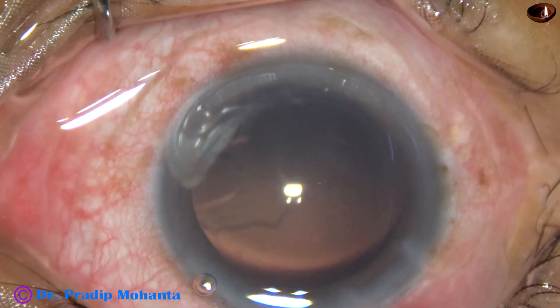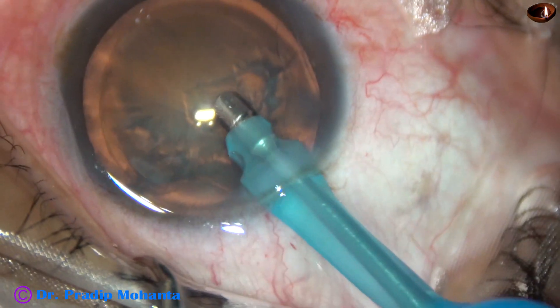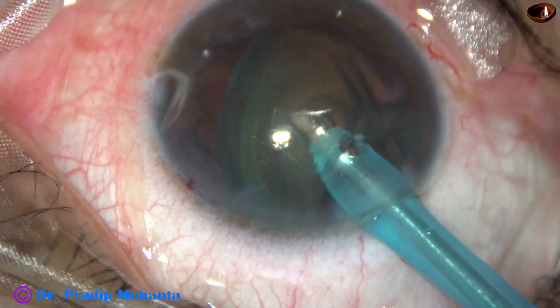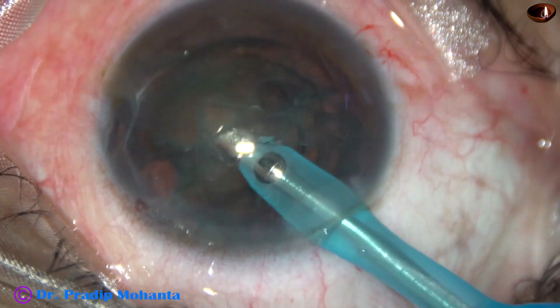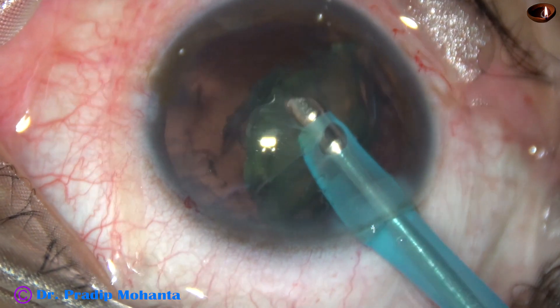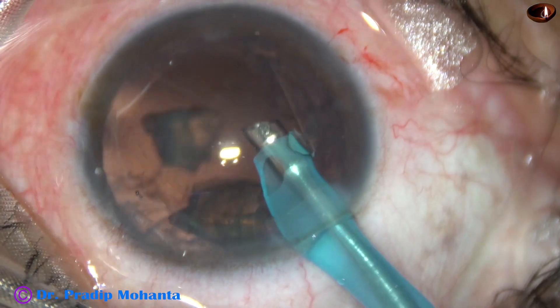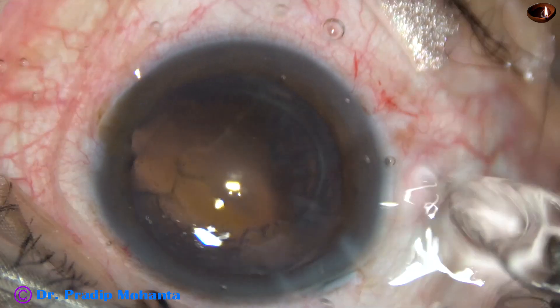Now let us see the last case — the fourth one. The tip goes bevel down. The lens tilts and then tumbles. I apply energy through the lens. It gets eaten off. And in a few seconds, the whole lens mass is engulfed. That's it — the nucleus is managed.